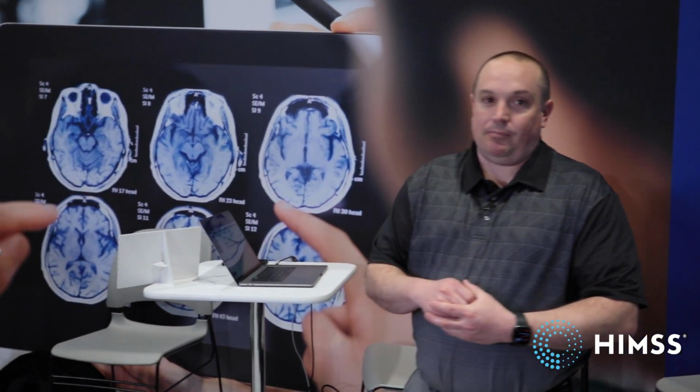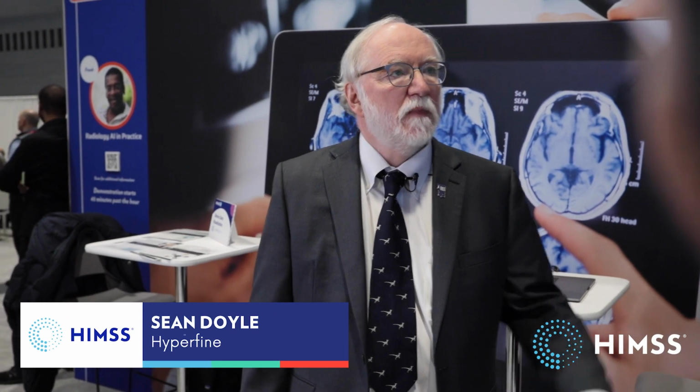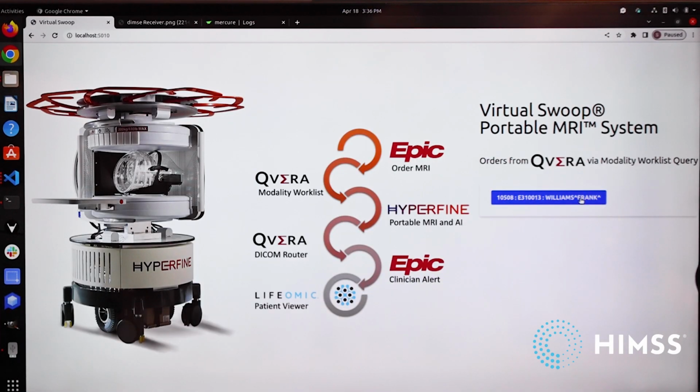Hi, my name is Sean Doyle. I'm a software engineer at Hyperfine. And on the modality worklist, you can see that the patient information has arrived. And like any modality device, we can select the patients off the list to get the demographics and ordering information. So if you could select that.